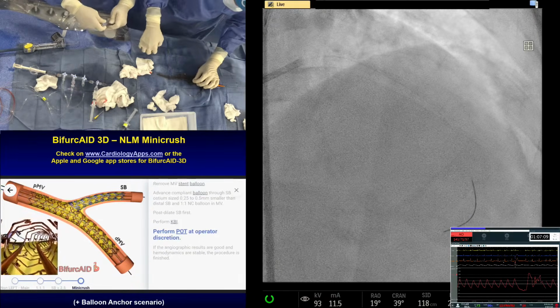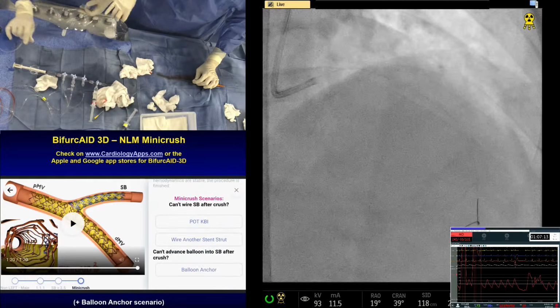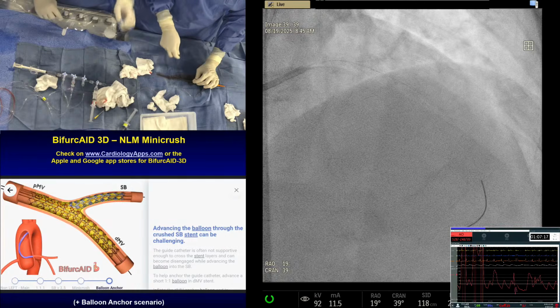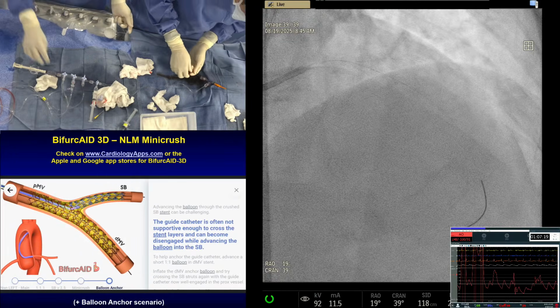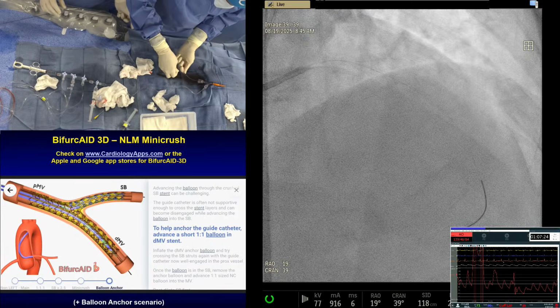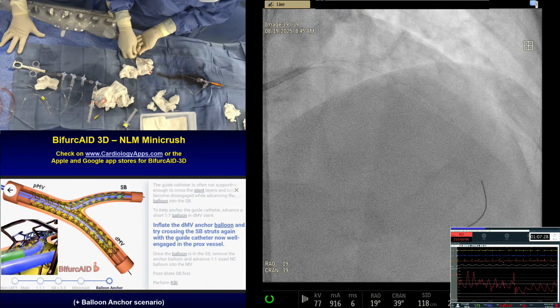remember that we do POT very often, but we have the paper in JACC Intervention. No, we don't do it often for non-left main. People do POT, but there is no scientific trial or basis. The one definite data we have is in the left main.